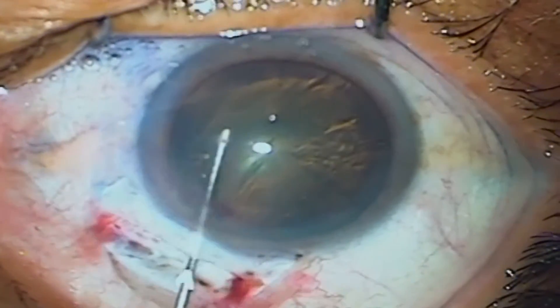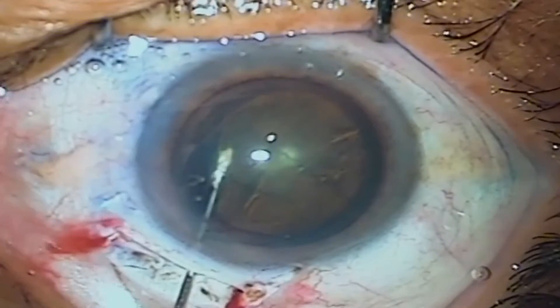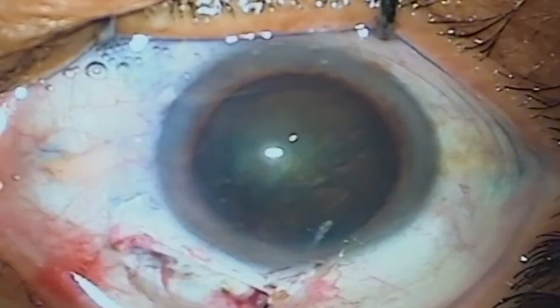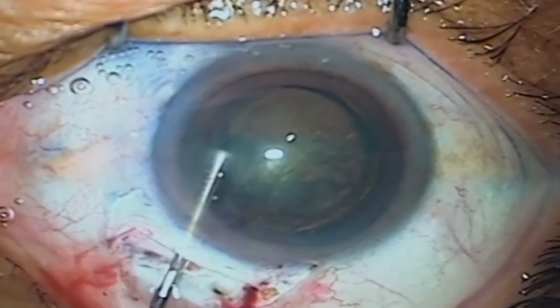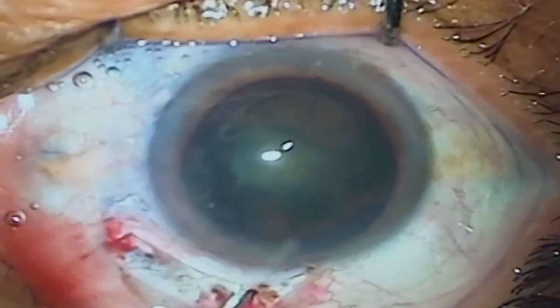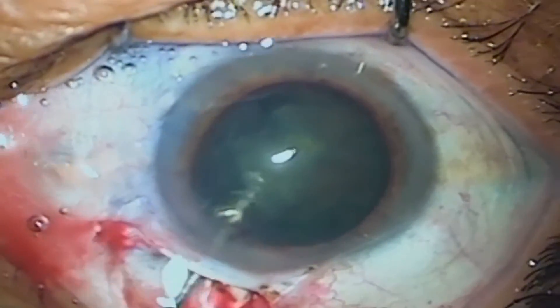In manual SICS with sclero-corneal incisions, when you touch the iris with instruments, cannulae, nucleus, or IOL, the pupil tries to become oval and the reaction is more. Although this oval pupil becomes round in 48 to 72 hours and reaction goes down by day five, the post-op result in manual SICS on day one is not as satisfying if the iris has been touched.